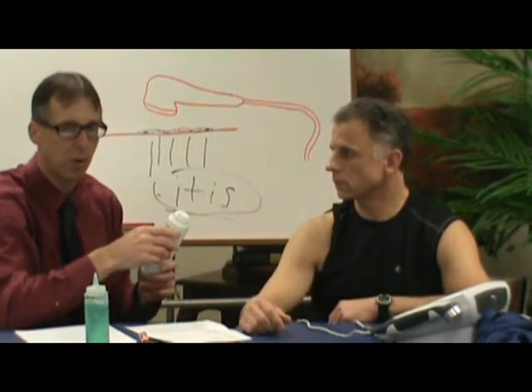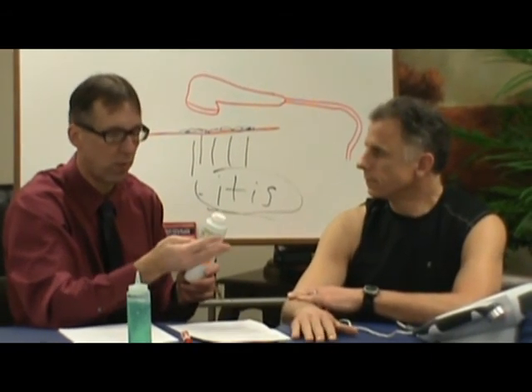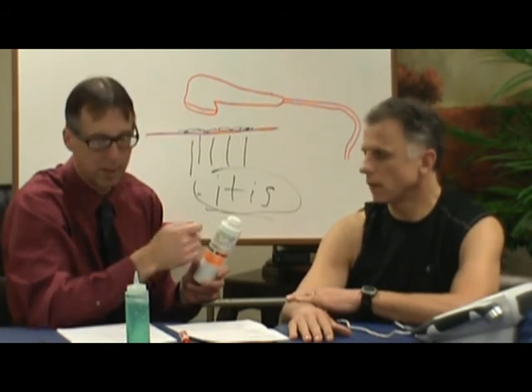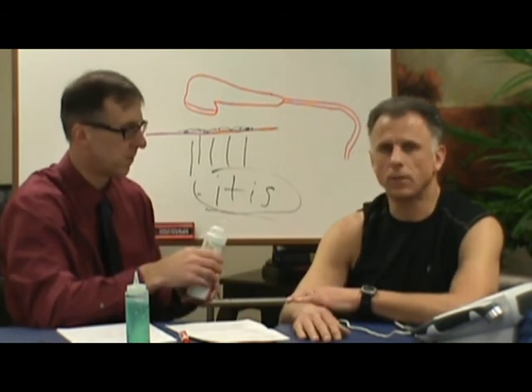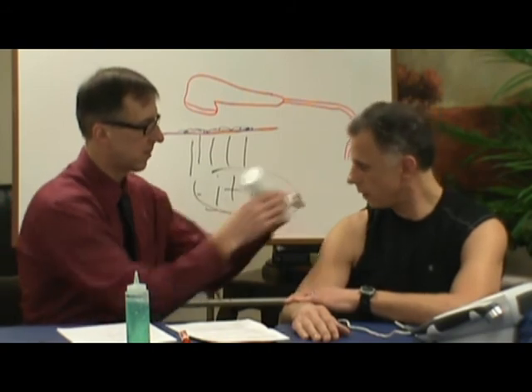This is called ketoprofen. It's an anti-inflammatory, and it works well in doing phonophoresis. Hydrocortisone cream is another one. Dexamethasone apparently is another one, which I haven't used, but I think you use it with iontophoresis, right? And that's up to the therapist. As a patient, you want me to put some on? You bet.